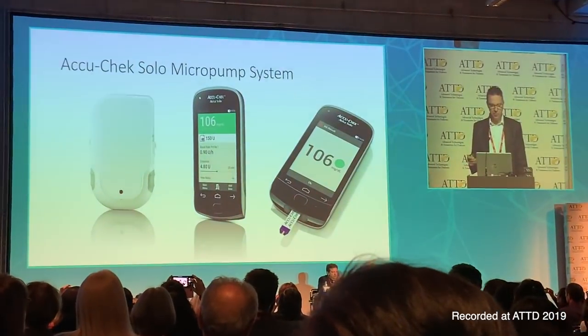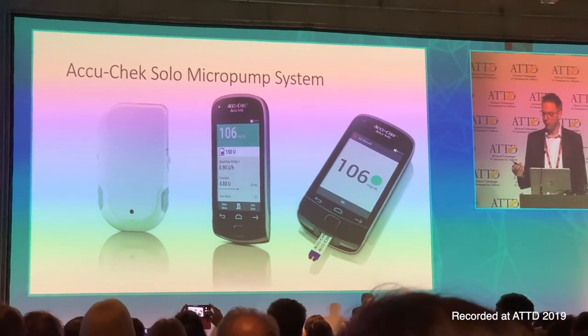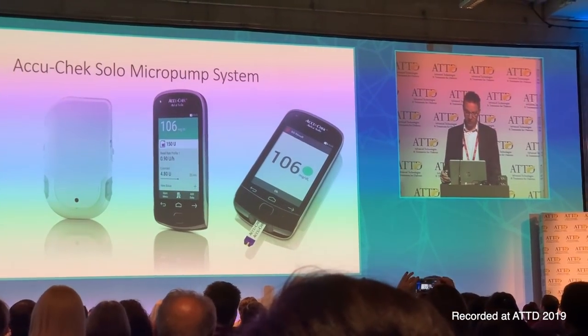It consists of the pump device on the left, and a handset which controls the pump, which includes self-monitoring of glucose functionality.